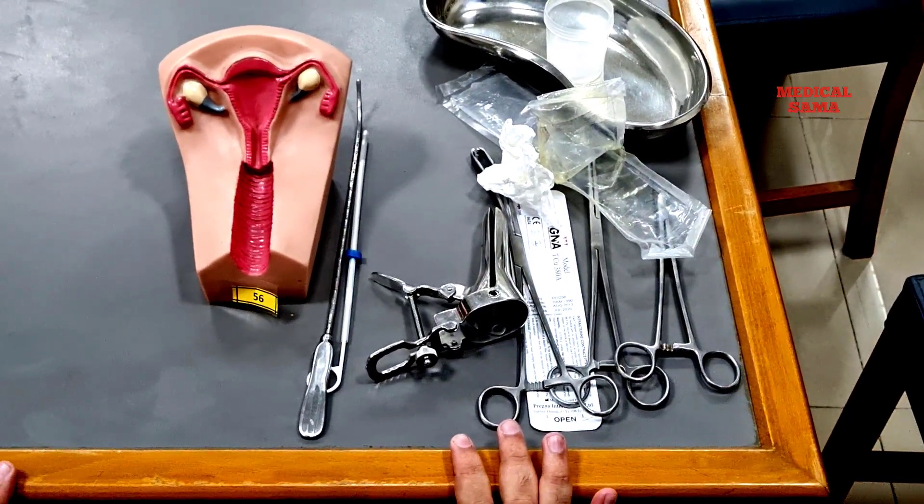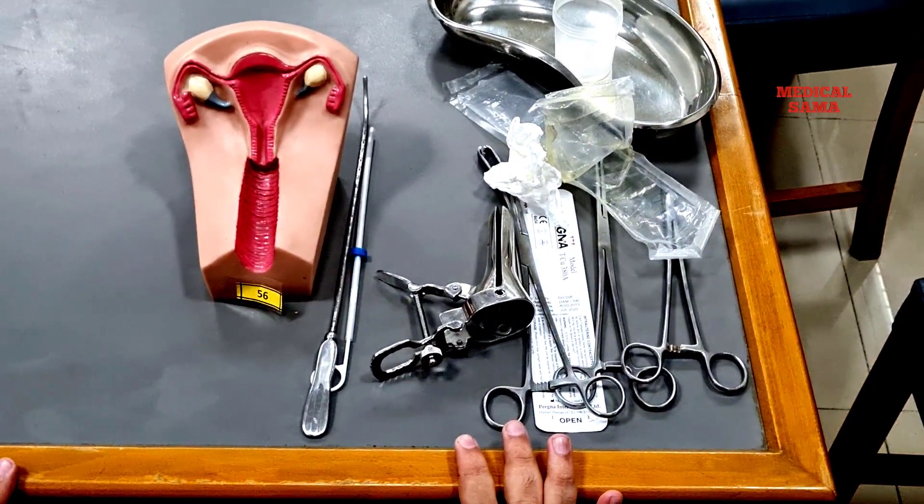Hello guys, my name is Ariya Sansali and in this video I will show you how to insert an IUCD in the female uterus.